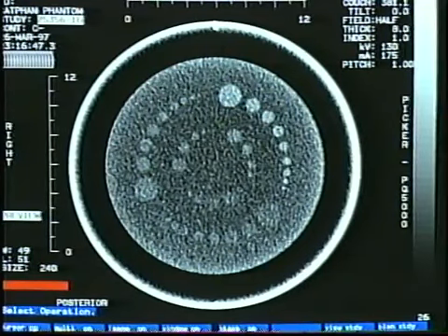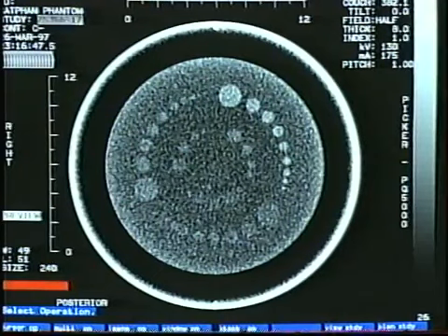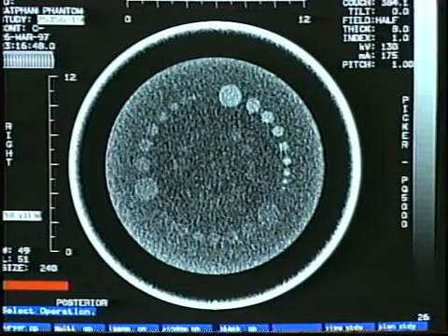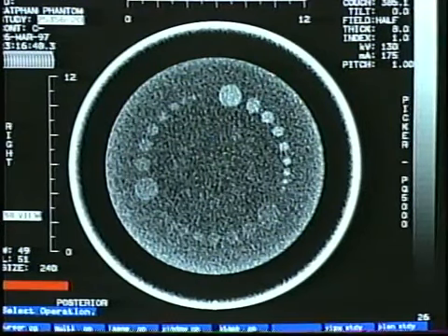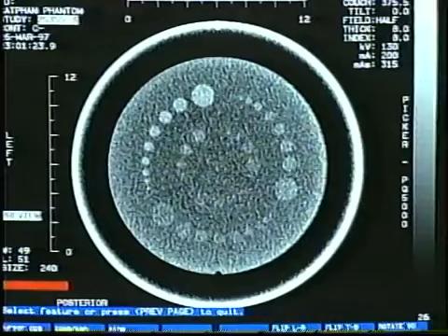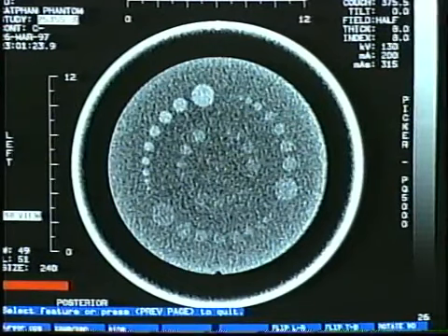The low contrast section can be used to study how changes in data acquisition parameters can change the scanner's ability to identify subslice targets. Interestingly enough, as you come to the midplane of the module, we run into the subslice objects, things that are thinner or less wide than the slice thickness. And you can see these objects will actually come and go in and out of the slice as the slice width sweeps through the subslice objects while maintaining the virtual resolution of the outer objects, which are the supraslice objects.